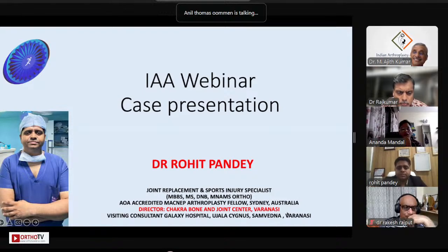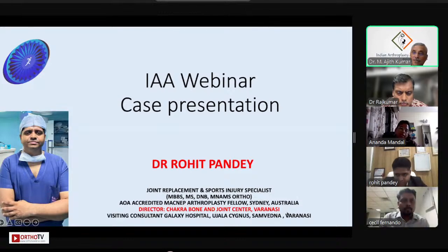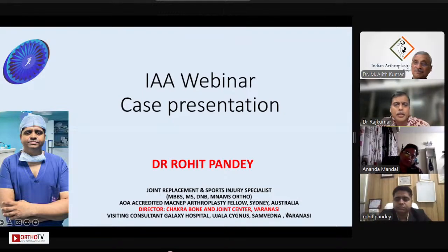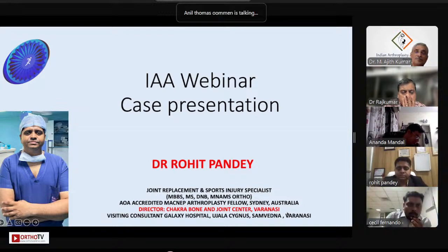Just to check, what modular stem was that he used? MRP Titan. Okay. So what was the distal diameter and what was the proximal diameter? I saw the fit, the fit is very good. I didn't have a lateral view there, but just wanted to check at 6 months. Two things. One is, at 6 months had it fully united? That could have been the reason for the thing because it's a well done case. And number two is, what was the size distal and proximal?